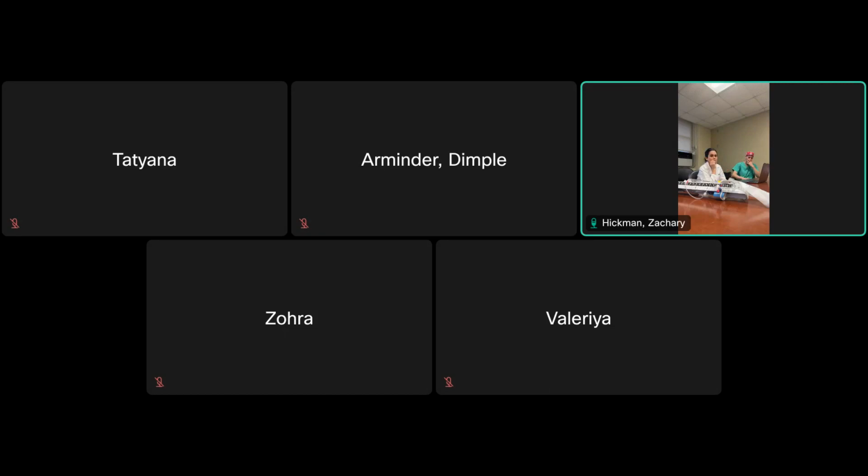Everybody ends up, when they're placing it, having their own biases as to how they miss. I used to aim for the nasion, because whenever I used the medial canthus, I tended to be too lateral. So I would use the nasion and stuff.